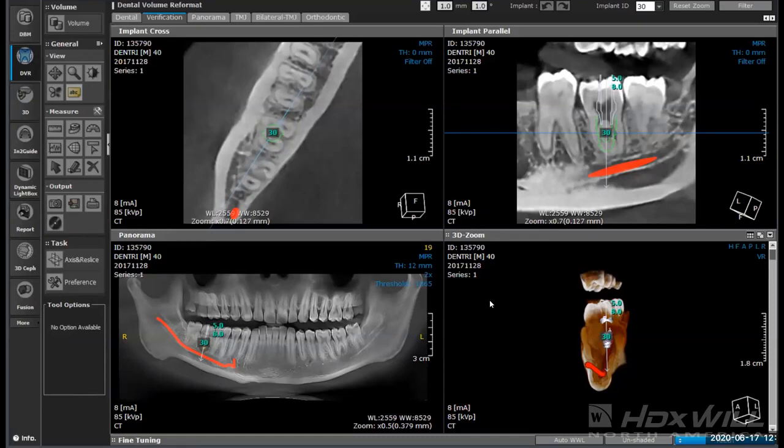Some of the things we don't know yet are about the soft tissue interactions, which means that we haven't gone through and actually looked at ways to, we've looked at the bone, but if this implant is a bone level implant versus a tissue level implant, what have you, we still haven't had anything that tells us more about our soft tissue interaction.